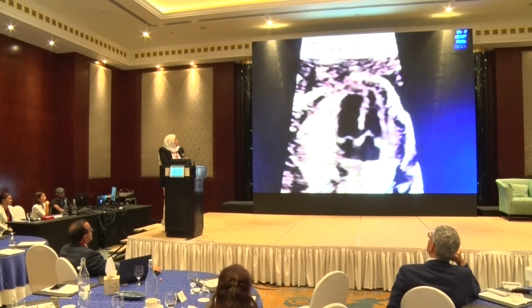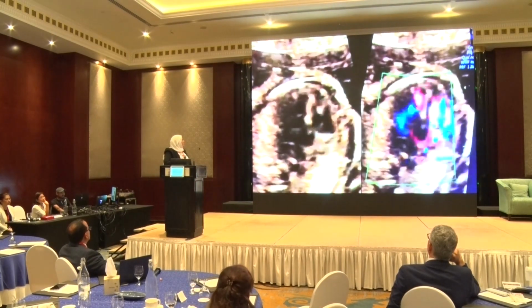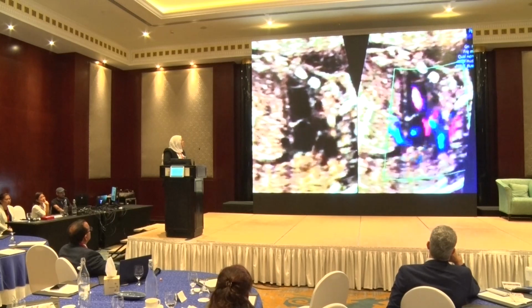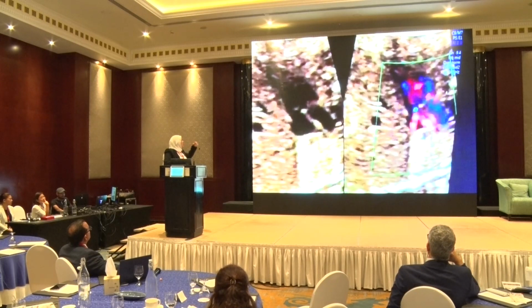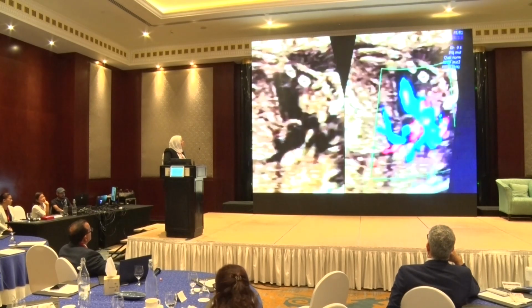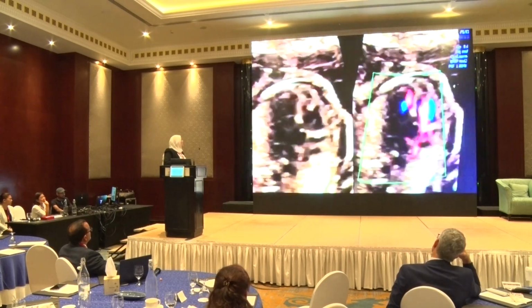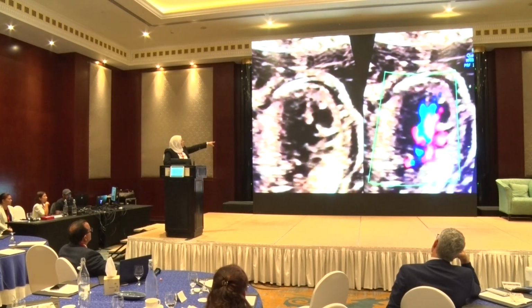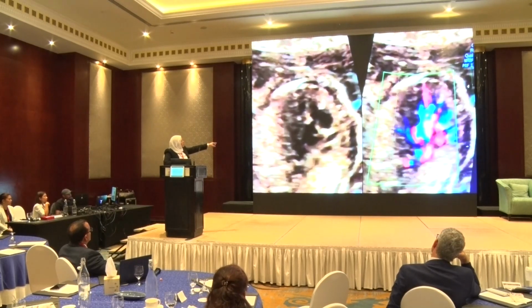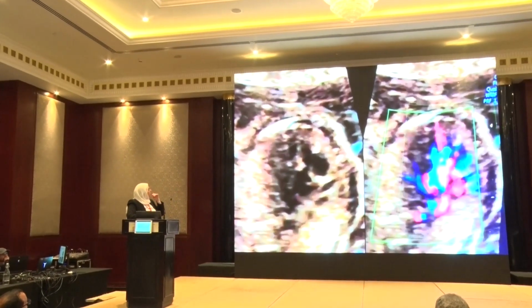This is one of our cases in Dubai Hospital, our team there. A case from the department found there is an anomaly in the heart, but they didn't differentiate it. If you go back a little bit, this valve, only one AV valve coming, but there is severe regurgitation. Malalignment VSD with overriding of one vessel. I couldn't see the other. And there is regurgitation in this valve.